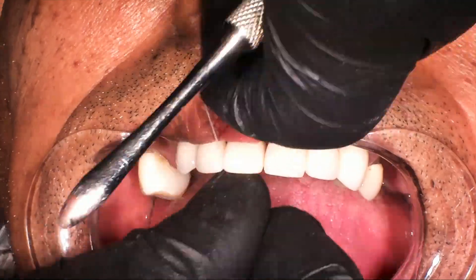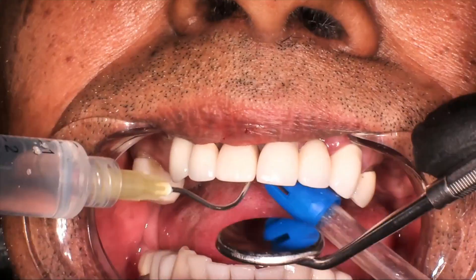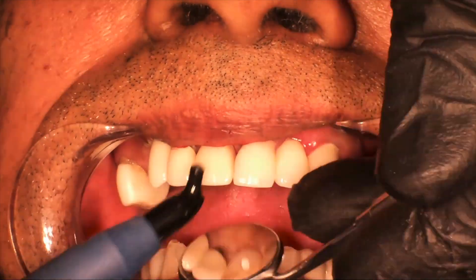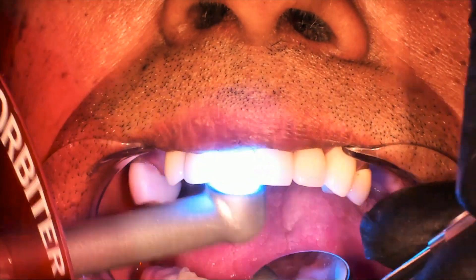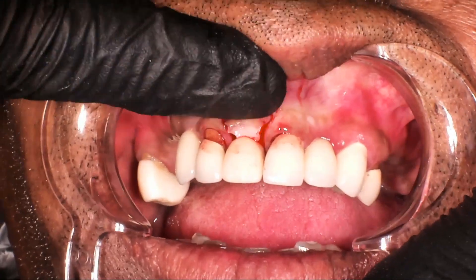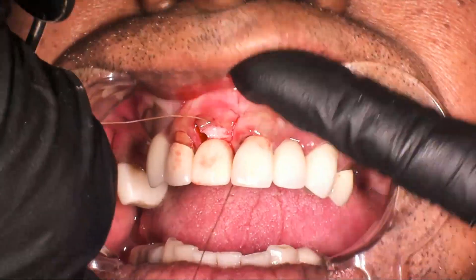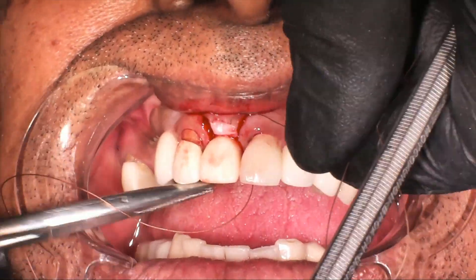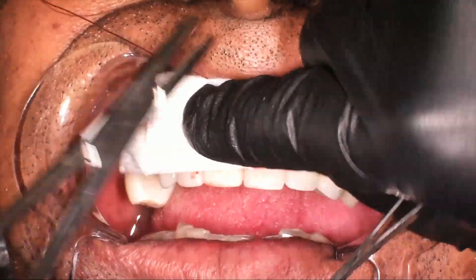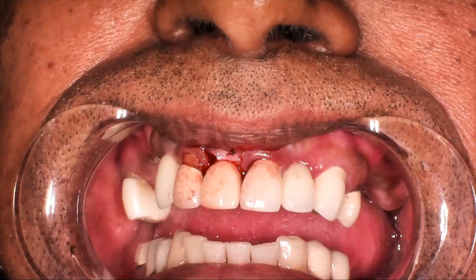Here's our pre-made CEREC implant restoration, screw retained. It's put into place — I've gently tightened it up, and then we're going to go ahead and torque it in. Now we're going to fill the excess with Teflon and composite. In theory, he now has his temporary in place. We're going to shape the tissue, and in this case because it's a little bit flabby, I'm going to put a very loose horizontal mattress suture in to just kind of help keep that in place — not too tight, but I want to let it go there.